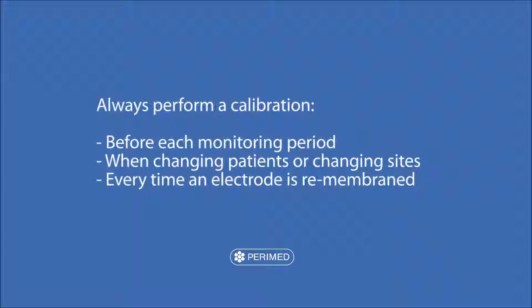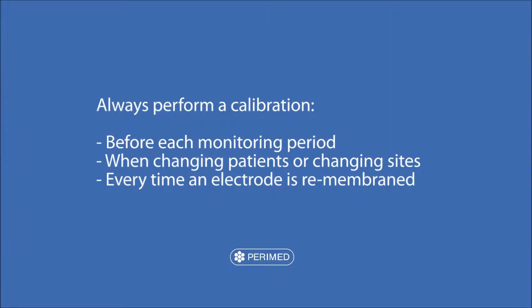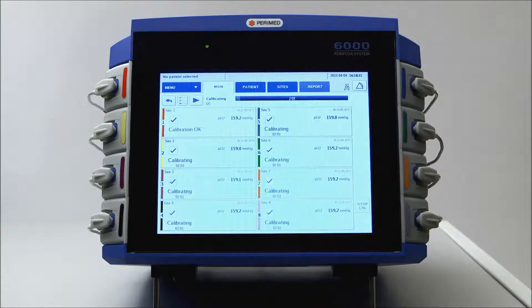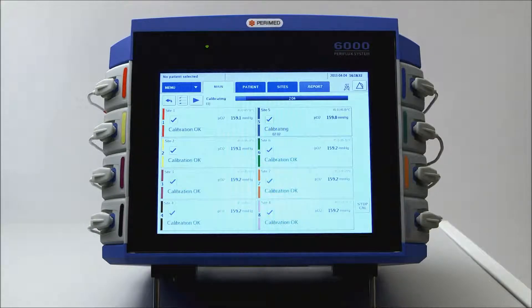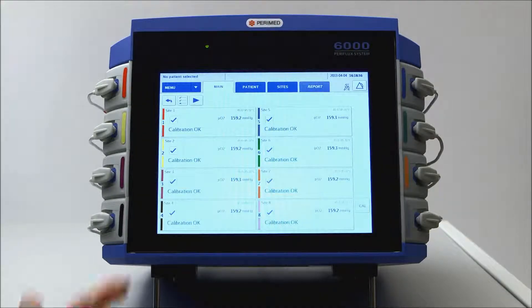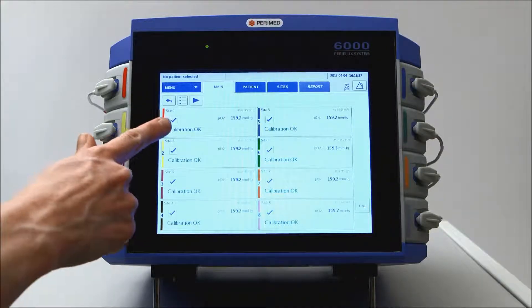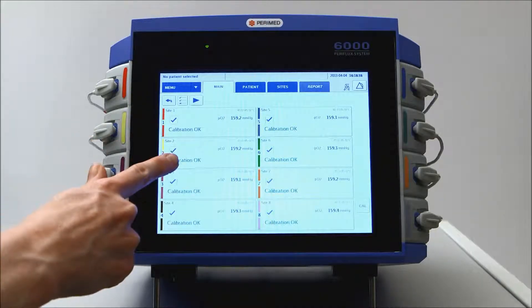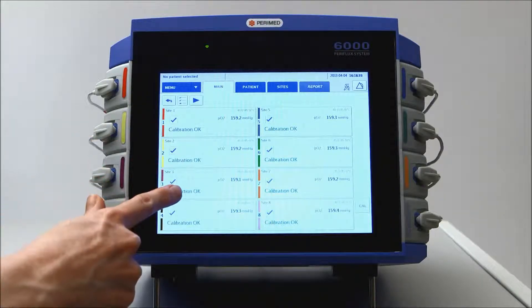You should perform a calibration before each monitoring period, when changing patients or changing sites, and every time an electrode is remembraned. Calibration OK indicates that the electrode is now ready to be placed on the patient.